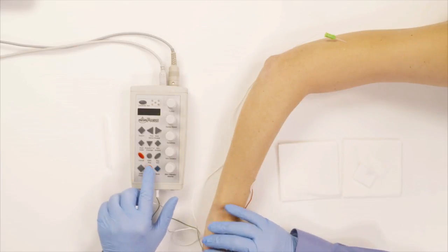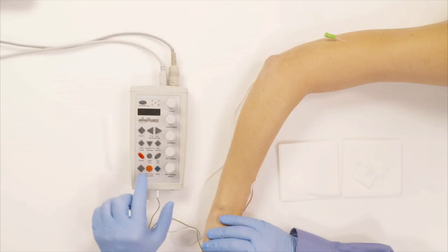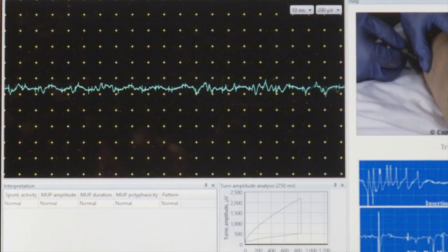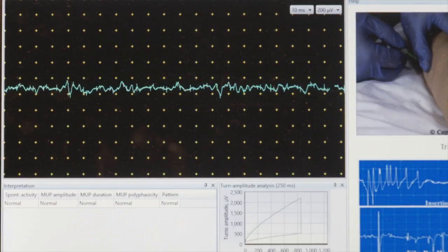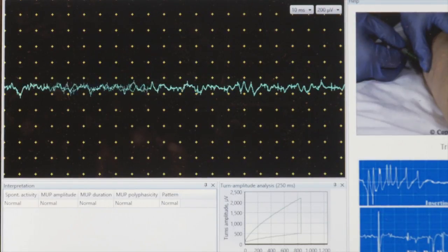The first thing I do, like I did with the other muscles, is press on this button here to show the insertional activity. When the muscle is at rest, the activity is usually completely flat.